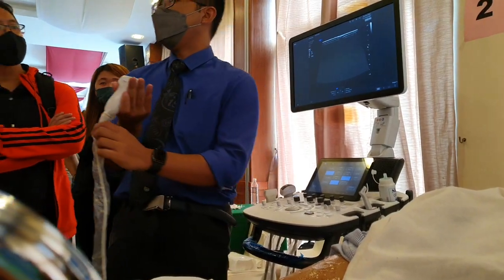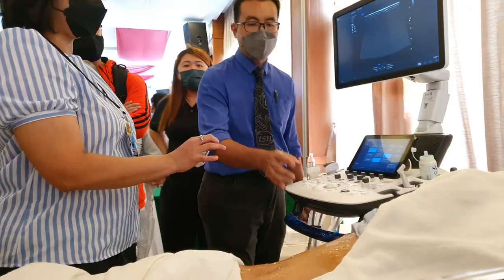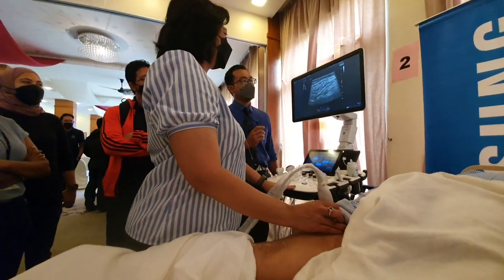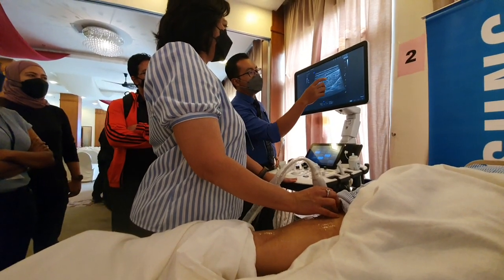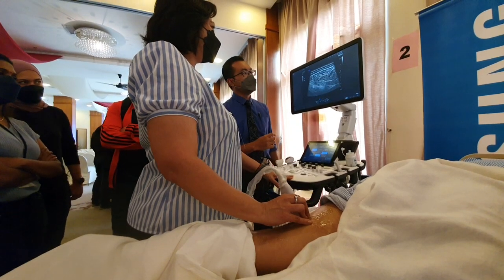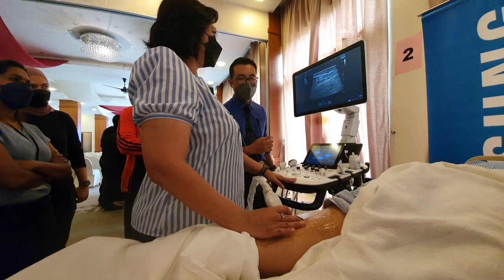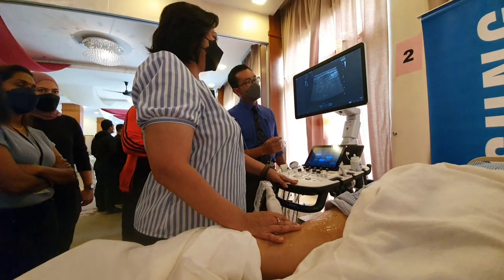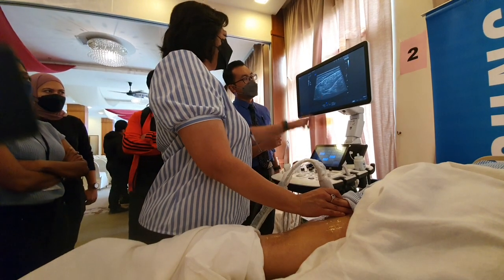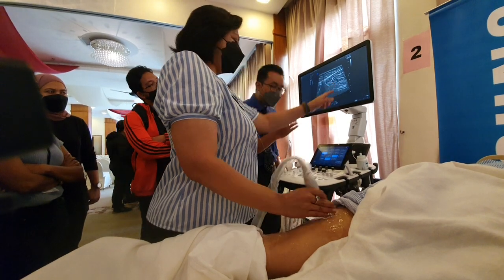Okay, so come. I mean, you can play around, and then you can try to determine which muscle is which. Okay, so let's say you want to determine this muscle here. So you just go down, down. Actually, this one is the direction.